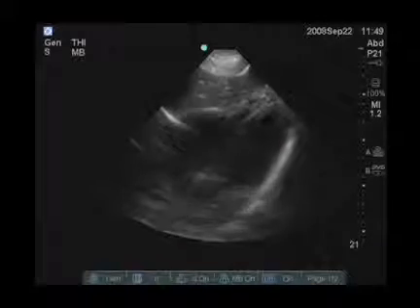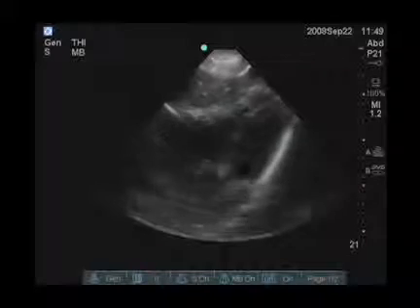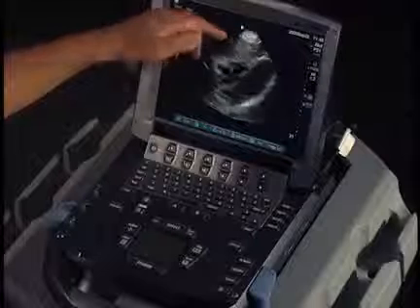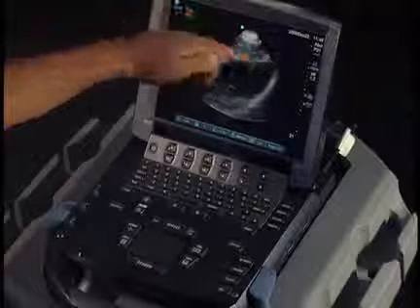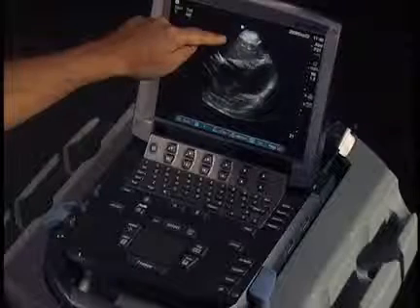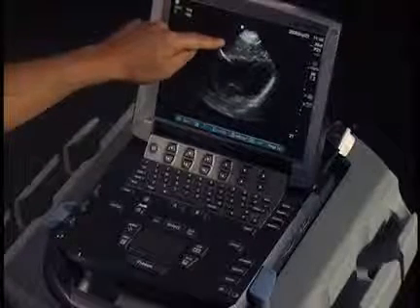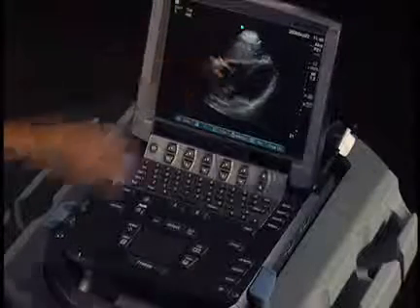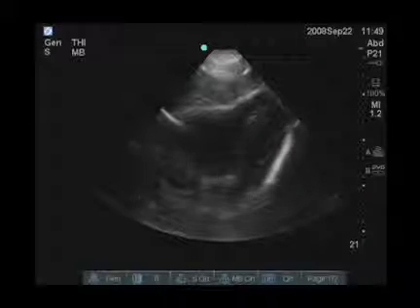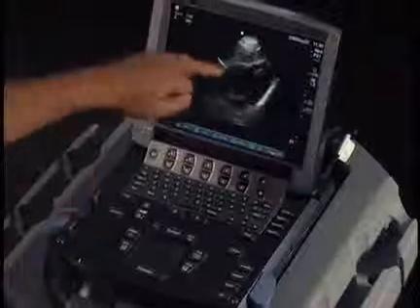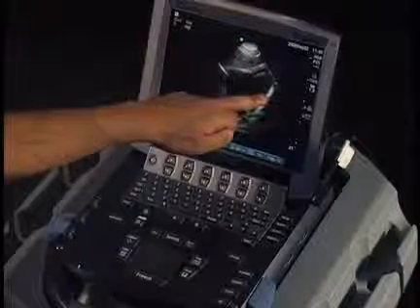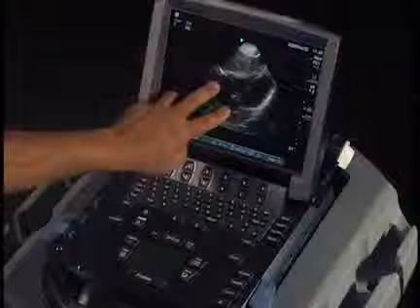Then we can identify the chambers, which are relatively easy to identify in this view. The chambers on the right side of the heart are here. The easy way to identify those: remember the liver is on the right side of the body, so the chambers adjacent to the liver are right-sided chambers. The large chamber adjacent to the liver is the right ventricle. On the other side, we see the left ventricle and the two atria.